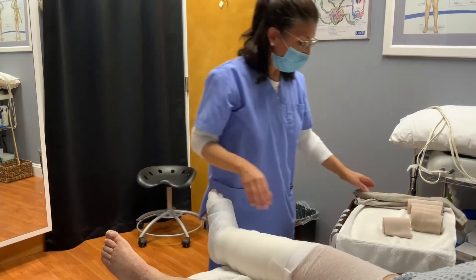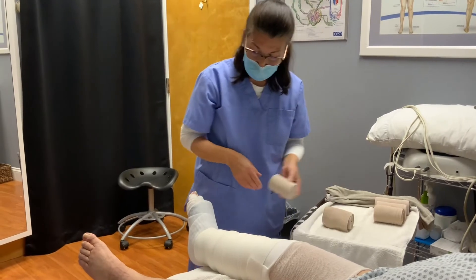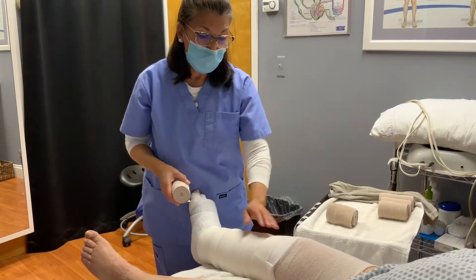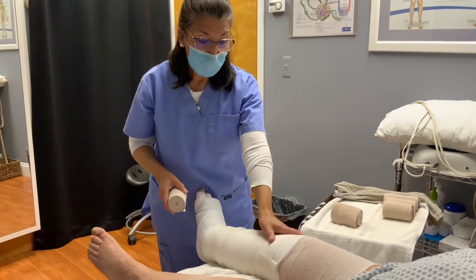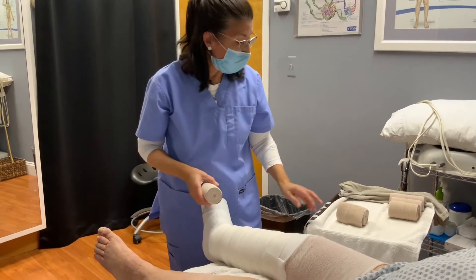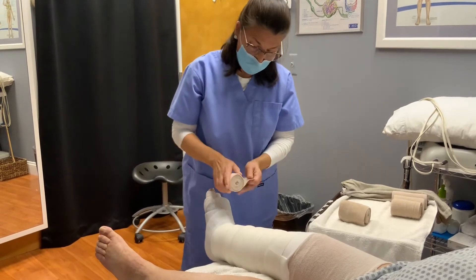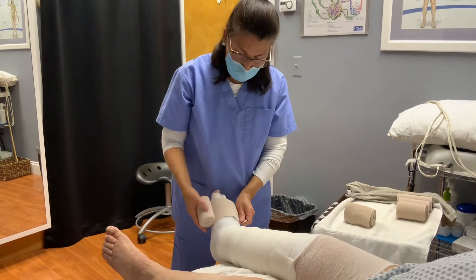Now we're going to start with the different size bandages. We're going to use a smaller one — an 8 centimeter for the foot, then a 10 centimeter for the lower leg, two of those in order to get up to the knee. Once we go above the knee, which we are wrapping today, we're going to use 12 centimeters above that. Always have your bandage roll away from you.